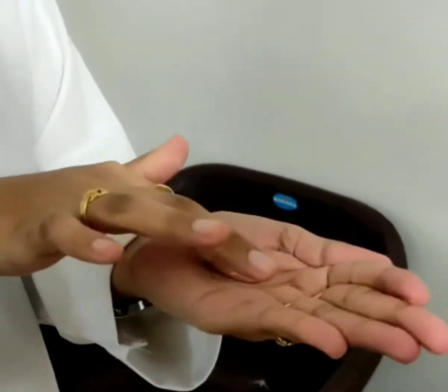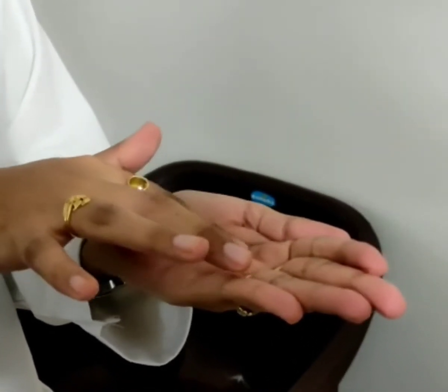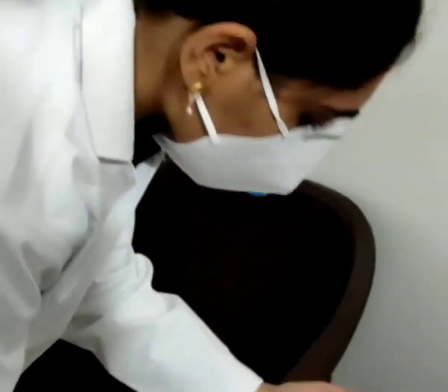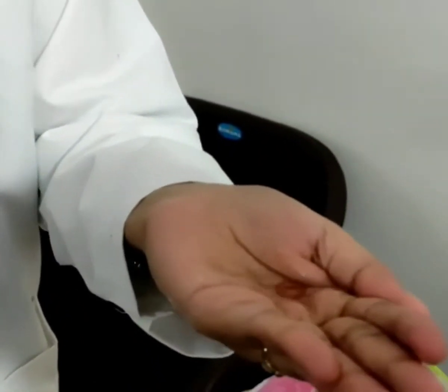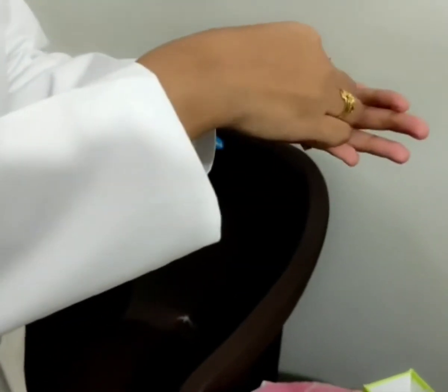Rub the lens well for 5 to 10 seconds in a to and fro motion. After rubbing, rinse the lens well with the contact lens solution.